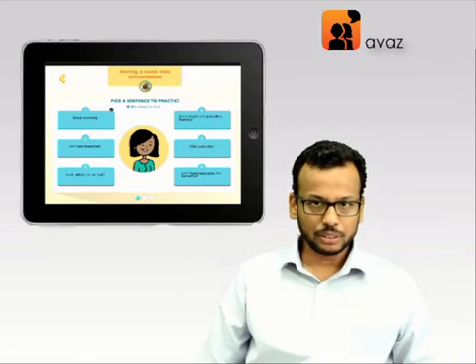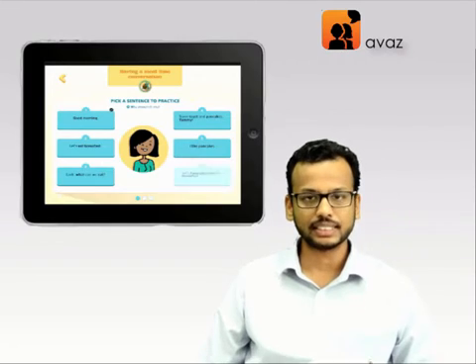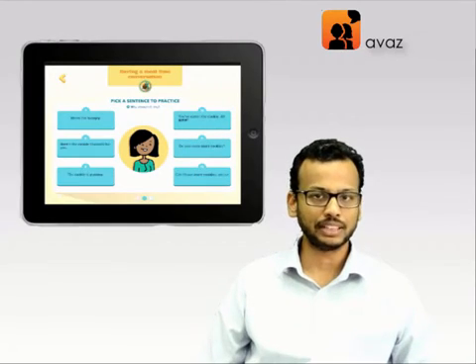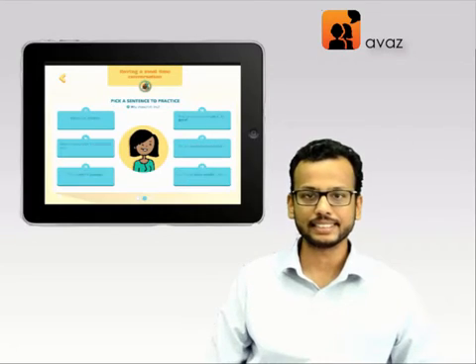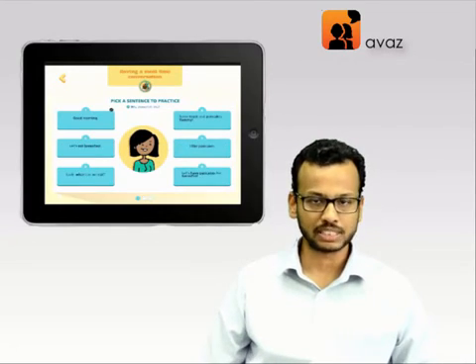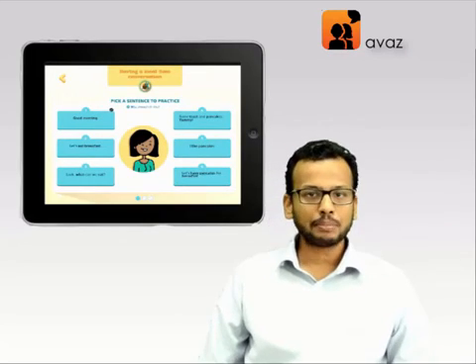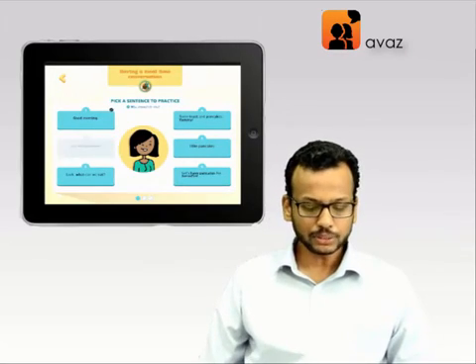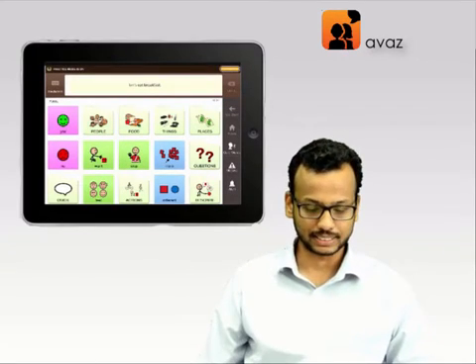If you look at this particular screen, there are 3 different sets of these 6 conversations. So you can actually swipe left and right to switch between these sets. So there are 18 sentences in all within one specific activity. The way that you practice these sentences is to tap on any one of them. And when you tap a sentence, it goes into the practice mode of Avaz.